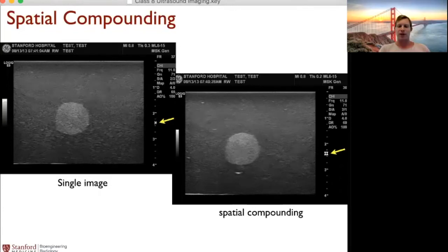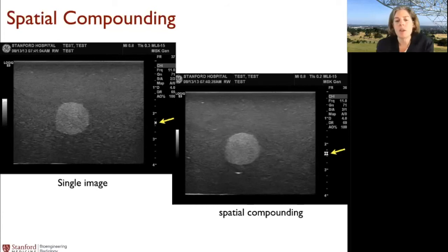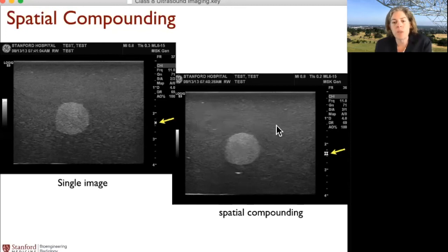So Kim, can you explain that a little bit more? Does that mean that you're only receiving one signal and that you're applying a phase and that changes the angle? So it's just like mathematical operations, but no more than one image, really? Yeah. So on the receive side, you can receive all the data, and then you can apply the phases to your subaperture to be sensitive to the line that's straight down. And then you can make up the image that way.